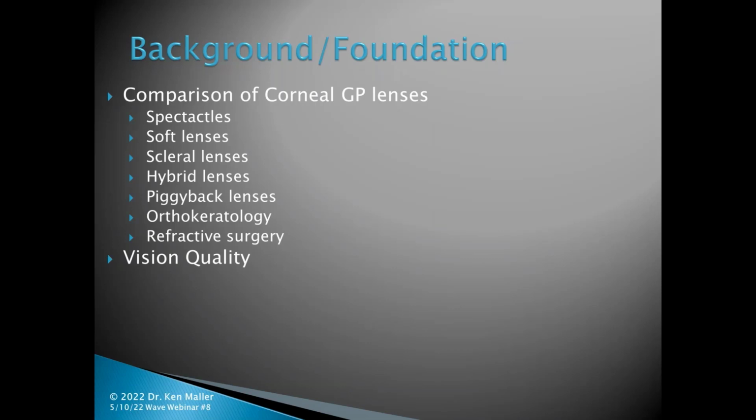Many patients, many of the doctors are under the impression scleral lenses are superior to corneal GP lenses, and that actually isn't the case. I've done several side-by-side comparisons with patients in my own office that I've been fitting with scleral lenses for a couple of decades now. And the big if here is if you can get a corneal GP lens to position correctly, it will generally outperform the optics of a scleral lens. For the other options there, it's clear that the corneal GP lenses win out in terms of vision quality.